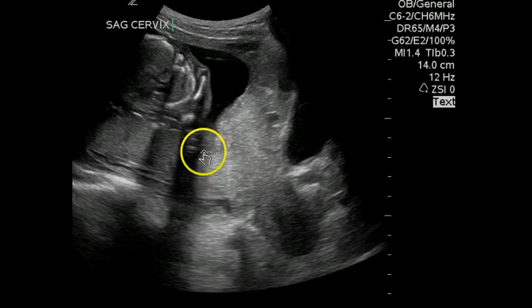All this echogenic area here is kind of suspicious. You're looking at that thinking, hey, could this be a previa? But the placenta is actually back here. So we're going to be worried about a previa, but I'm thinking, looking at this, it's probably a lower uterine segment contraction. And she's fortunately measuring the cervix in about the area that I would suggest we would measure it.